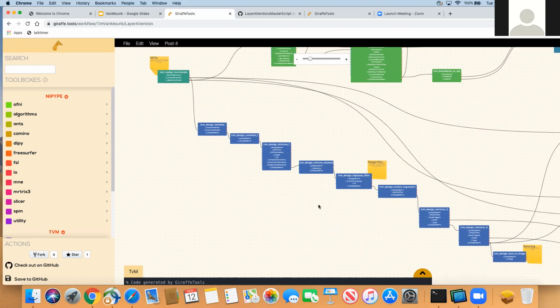So whenever you implement a new toolbox, but you're relying on other software, there is always the danger that here and there you get back to dependencies. Are there any intermediate questions?